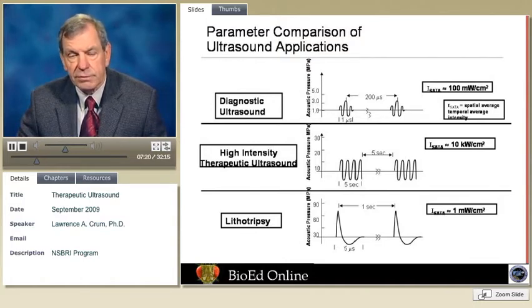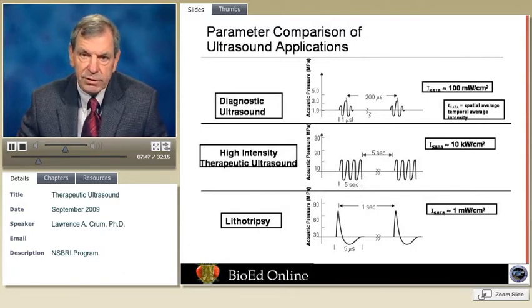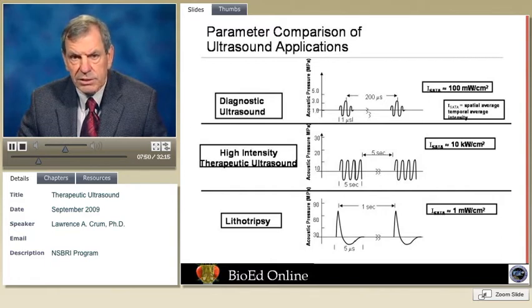And let me compare that with the technology of therapeutic ultrasound, similar to the one you saw with the movie of the Fry brothers. In this particular case, the pulse is no longer 1 microsecond, but let's say on the order of 1 second, a million times longer. And instead of waiting 200 times the time between pulses, one waits on the order of the same amount of time. So it's on for 1 second, off for a second, on for another second, and so forth. As a consequence, the total intensity, or let's say energy applied, is almost 1 million times larger. But in this particular case, we're interested very much in having a therapeutic effect or a biological effect.